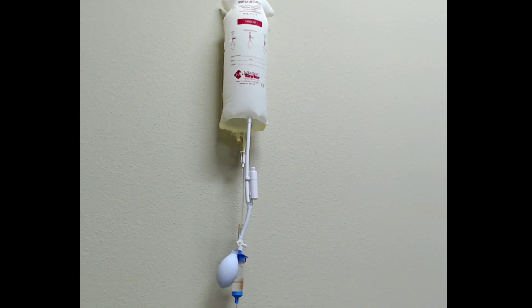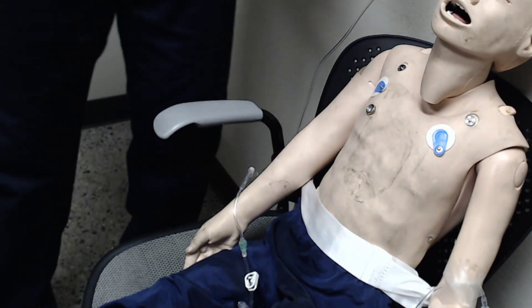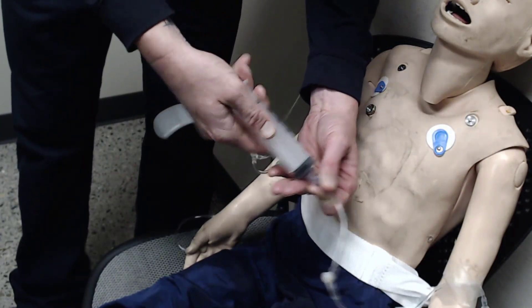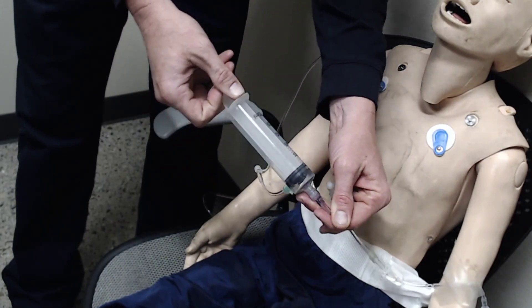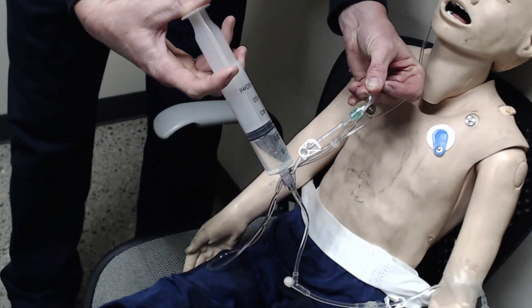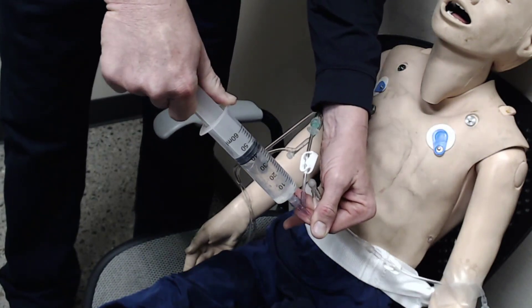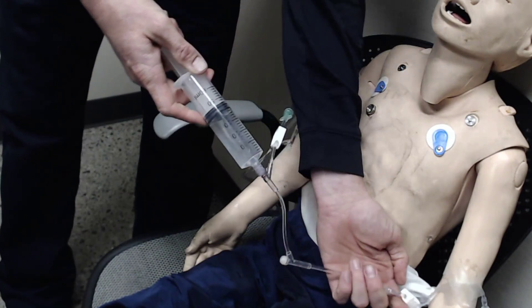Now the push-pull technique. We have our line established. The easiest way to do this is to grab a syringe — if we're going for fluid, you want a larger syringe, so here I have a 60 cc. I'm going to screw this into the needleless port, check all my kinks, open up my line, pinch it off to the patient, and draw fluid from my bag. Then pinch to the bag and push to the patient. Continue to do this — obviously giving the full syringe each time. Pinch to the patient, pull from the bag, pinch to the bag, push to the patient. Pretty easy technique.